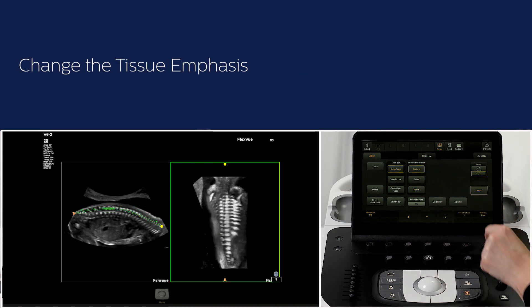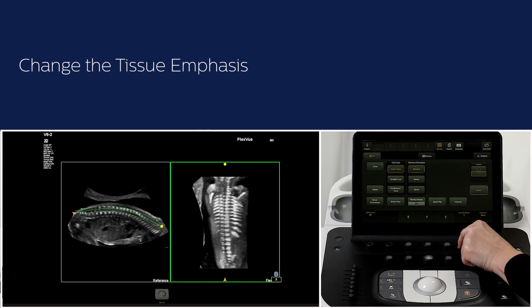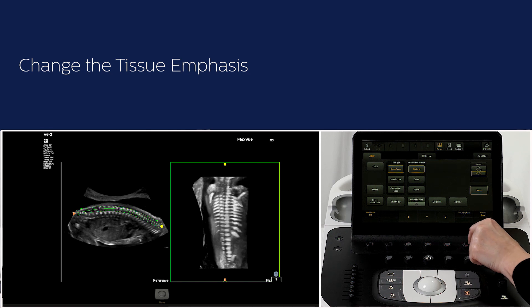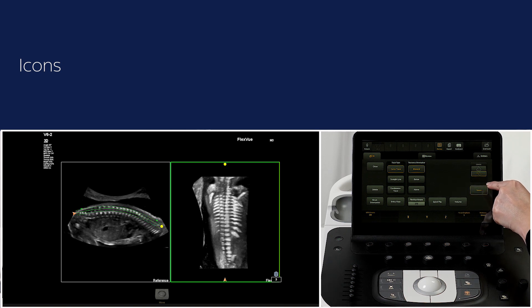Four settings are available that can change the appearance of the strong interfaces from intense to soft. Change tissue emphasis by choosing a setting between one and four.